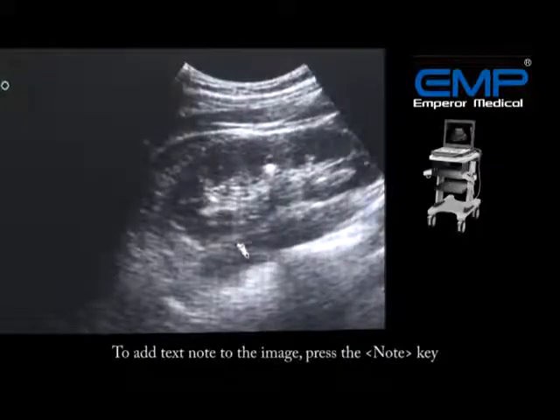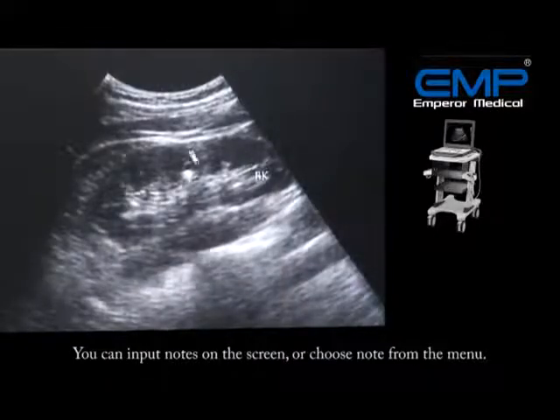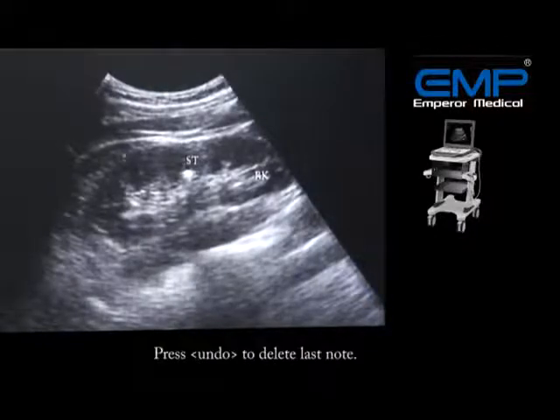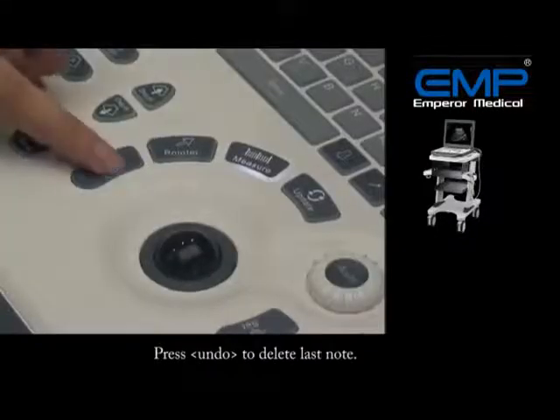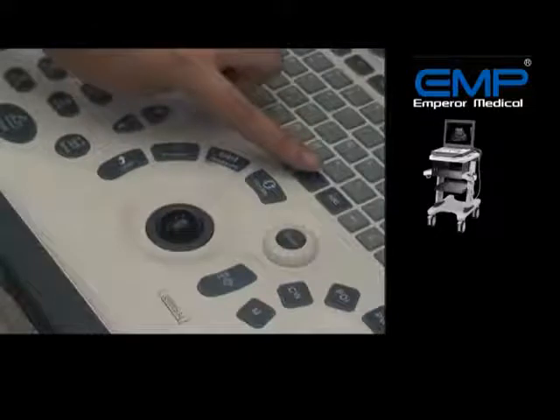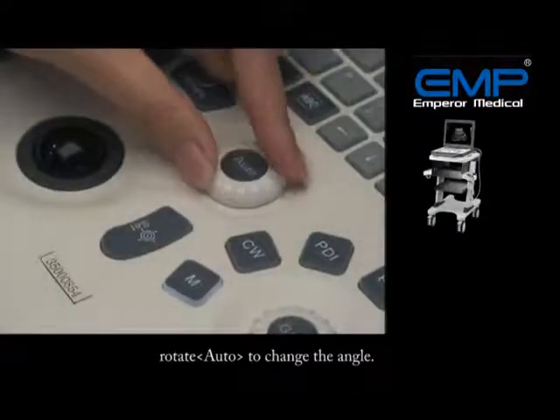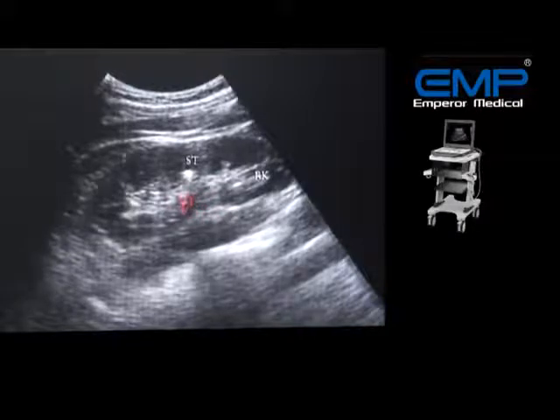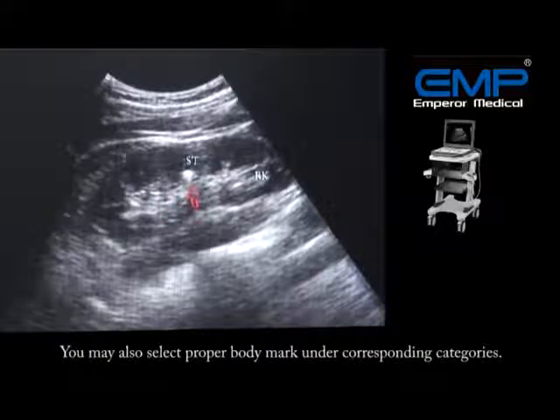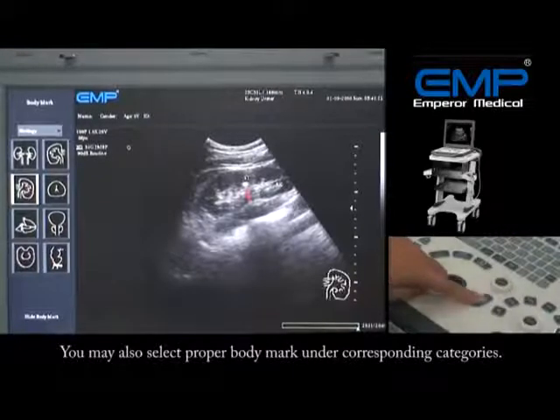To add a text annotation to the image, press the Note key. You can input annotations on the screen or choose a note from the menu. Press Undo to delete the last annotation. To add an arrow mark, press Arrow. Rotate the knob to change the angle. You may also select a body mark under the corresponding categories.